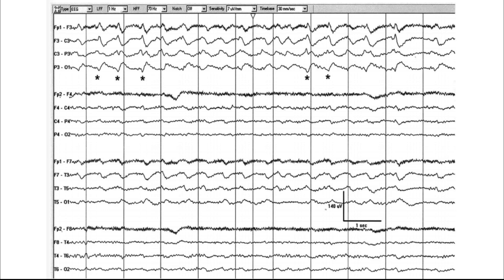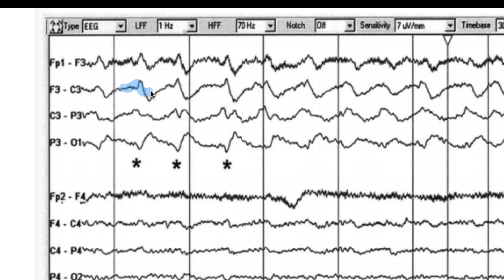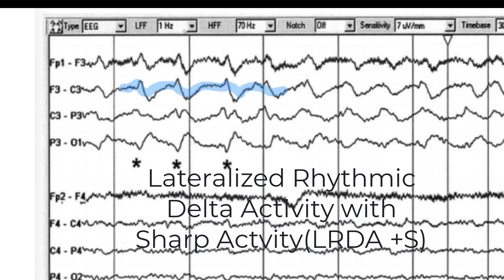Here is an example of a continuous rhythmic pattern maximal in the left hemisphere. There is no clear inter-discharge interval, so we use the main term RDA or rhythmic delta activity. It is exclusively maximal in the left hemisphere, so we call it lateralized. There are superimposed sharply contoured waveforms, so we add the term plus S. This gives us lateralized rhythmic delta activity plus spiky component — LRDA plus S.